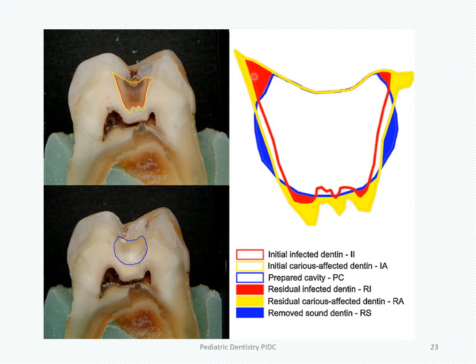All right, because if you're not removing this infected dentine, over a period of time it will disintegrate and the food lodgement will start, and then the plaque accumulation, food lodgement, and new secondary caries or recurrent caries will start, and it will reach the pulp very fast, and from the top it will look as if nothing is wrong. So this slide basically tells you how careful you have to be when you're doing caries excavation and cavity preparation.